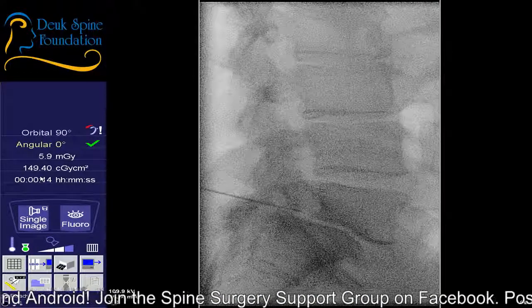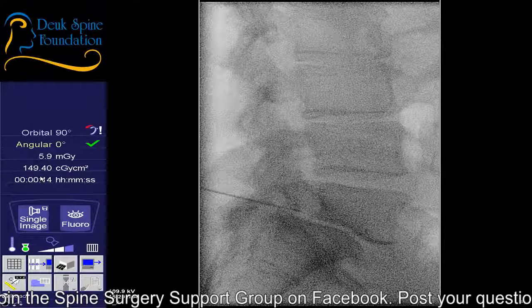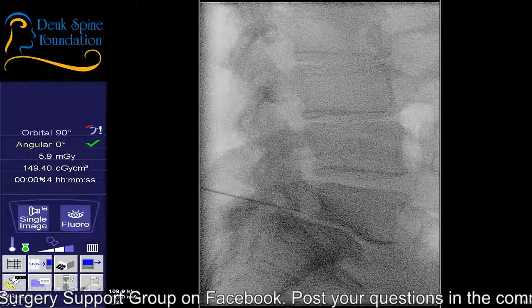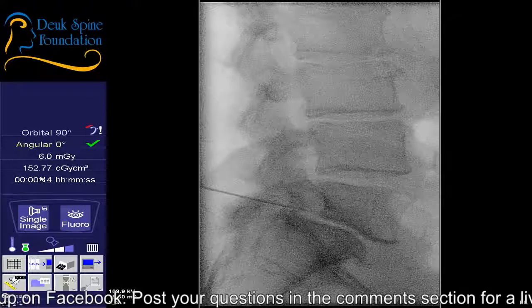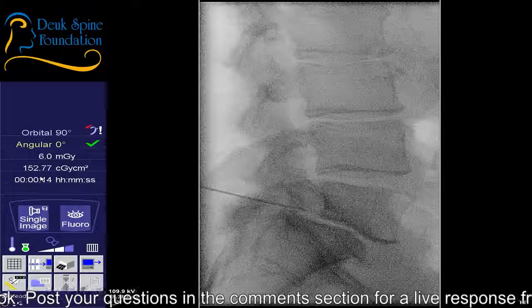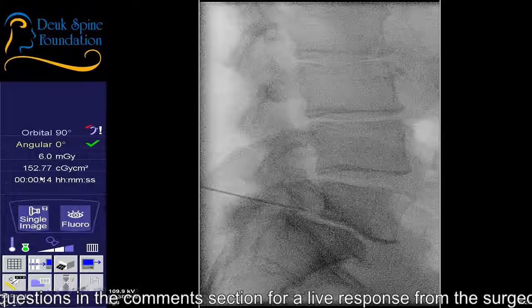I may want to start a little bit higher and come in. I'm not happy with where it is. Any discomfort? Those pedicles, let's see if we can wag a little bit and just get them better. I don't think we're too far off, to be honest with you. I think we're at most 1 degree.